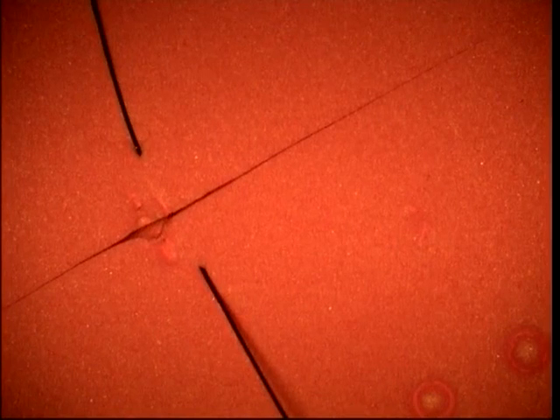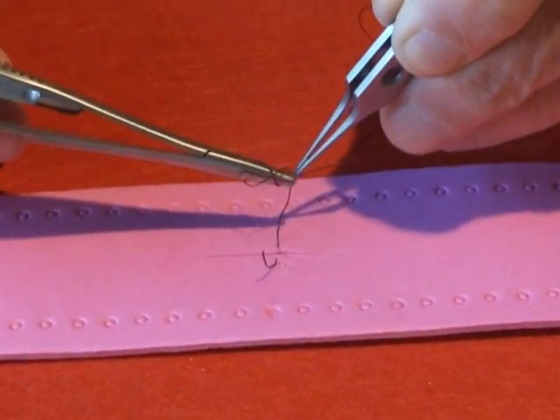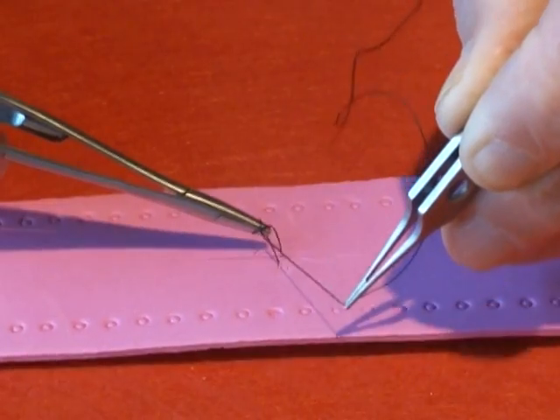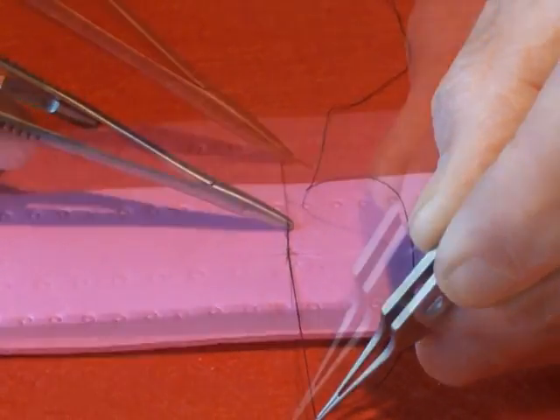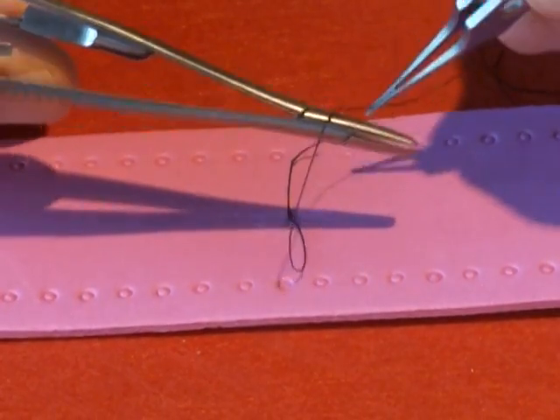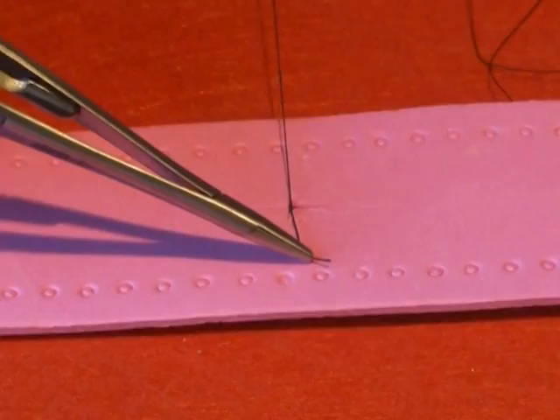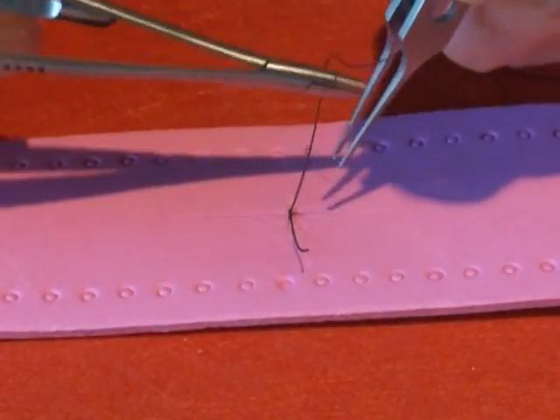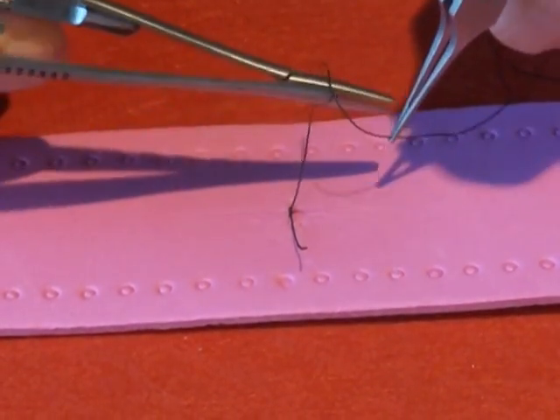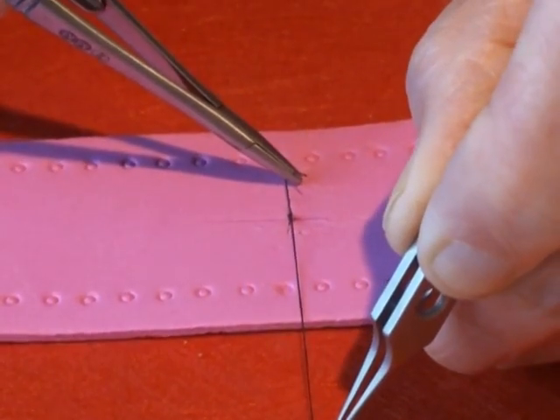Now you have to tie the knot. The standard surgeon's knot uses a double throw forwards, then a single throw back, and a further throw forward. This is called 2-1-1.